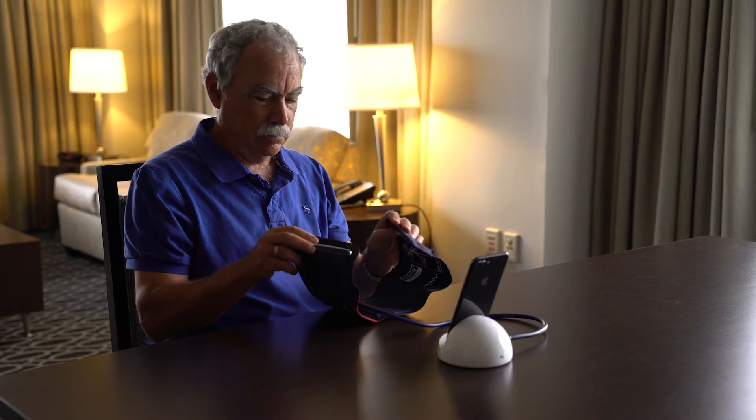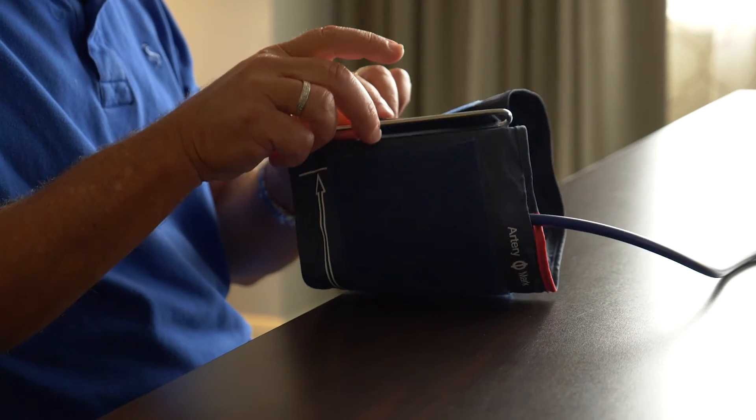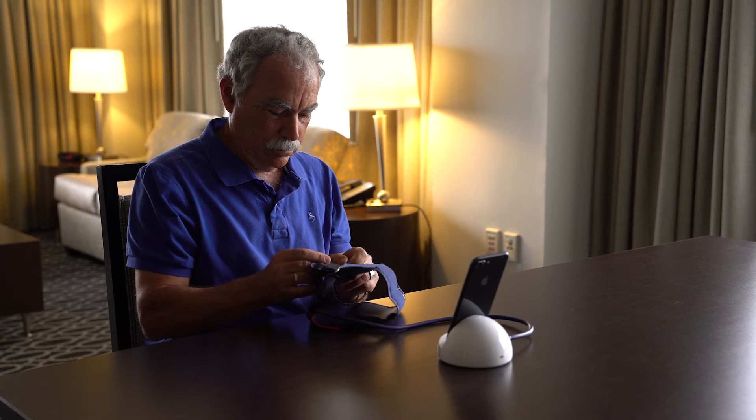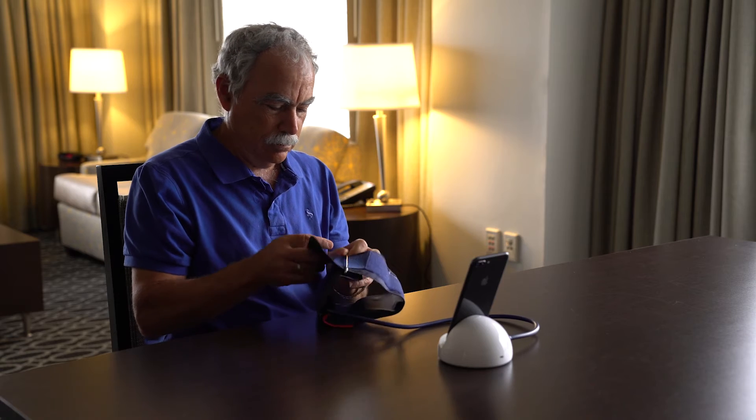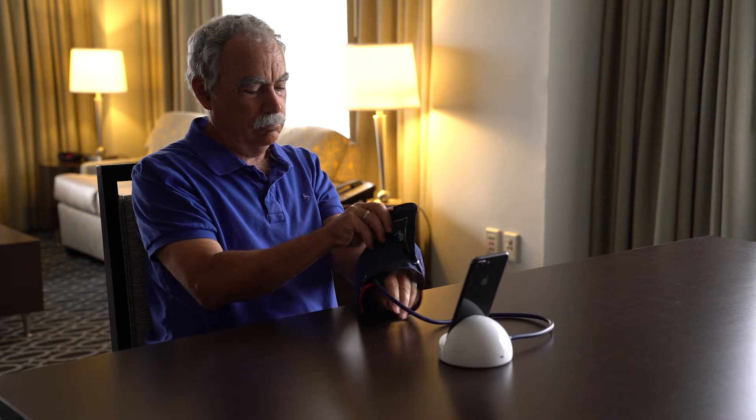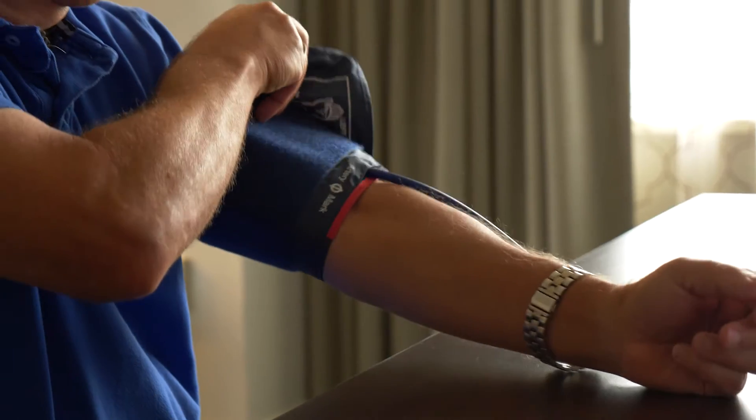Next, pull the cuff end through the metal loop, keeping the velcro on the outside. Stretch out your arm palm upward. Place your arm through the cuff.